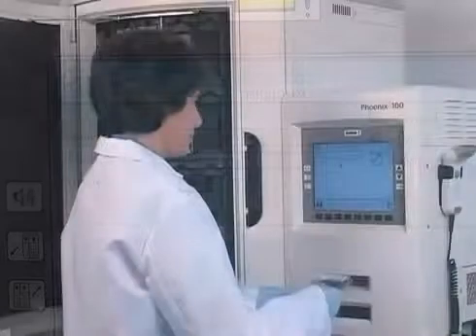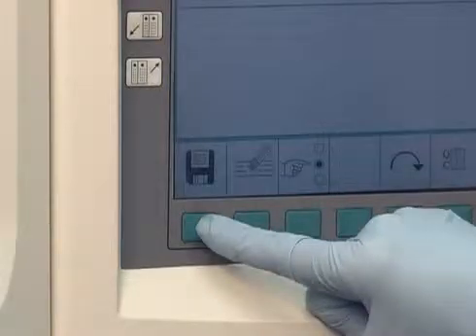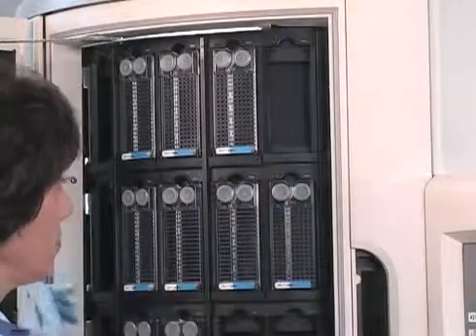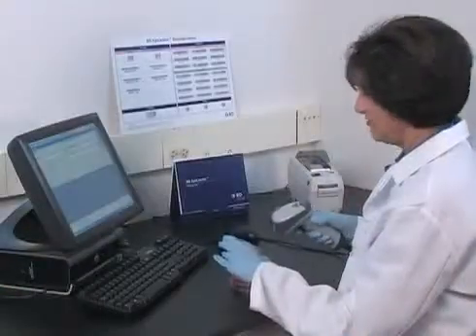Save the information when this step is complete, press the load panel soft key, and insert the panel into any vacant carrier in the instrument. Close the door and testing begins automatically. Login can also be performed at Epicenter or the laboratory's LIS system.